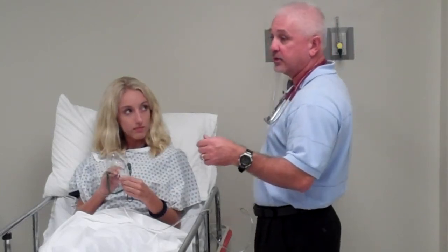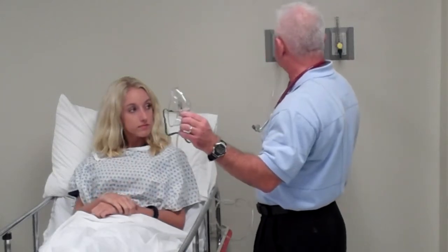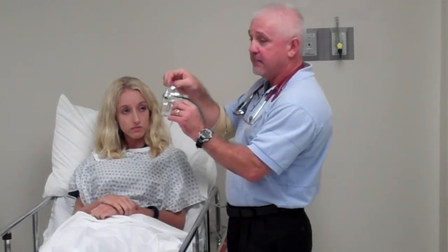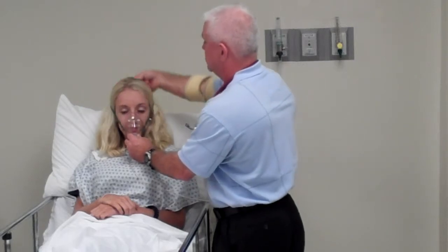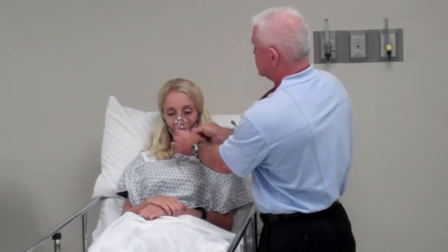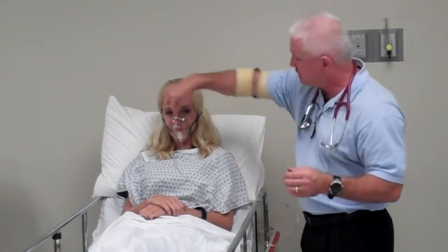And the doctor's ordered a 35% simple mask. So now I'm going to set this at 5 liters per minute. The reason it's at 5 liters per minute is that it has to have a minimum amount of flow because we want to make sure that when she exhales, the CO2 that she's exhaling will escape through these holes on both sides. So this is a 35% simple mask.